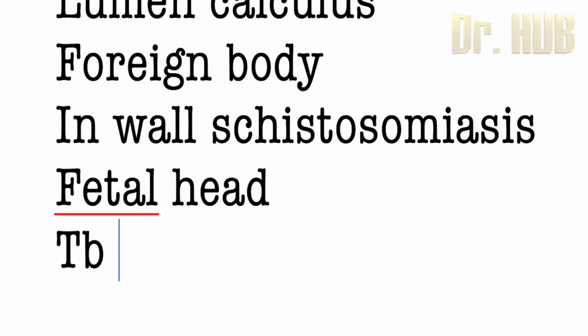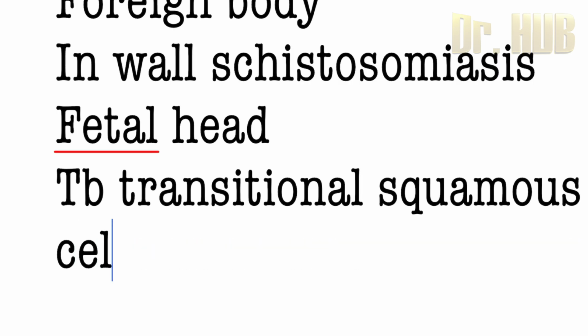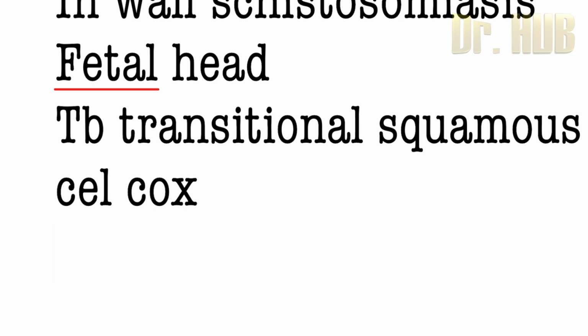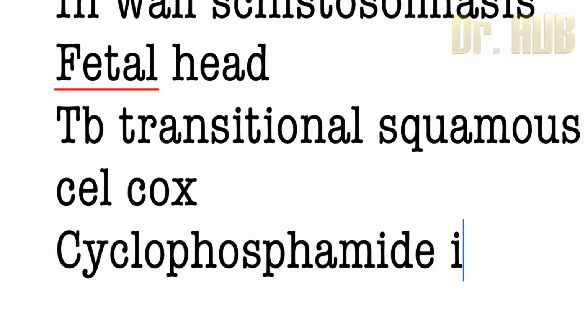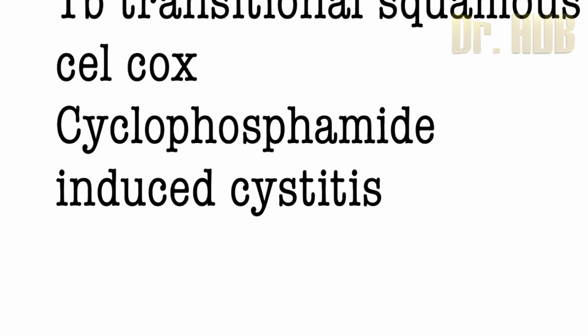And also TB, transitional and squamous cell carcinoma, and cyclophosphamide induced cystitis.